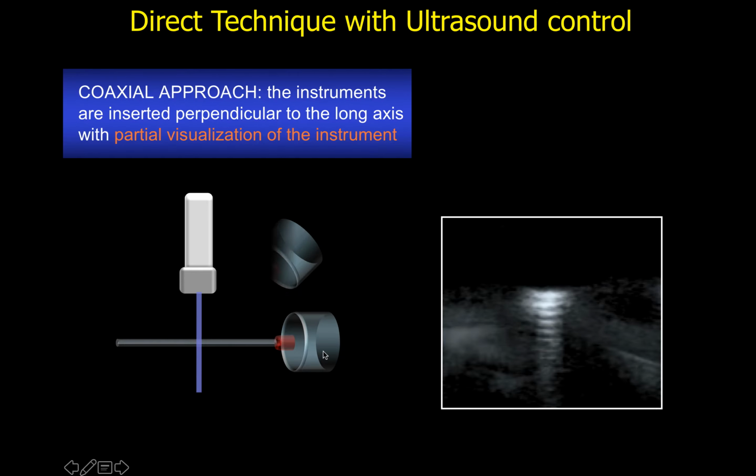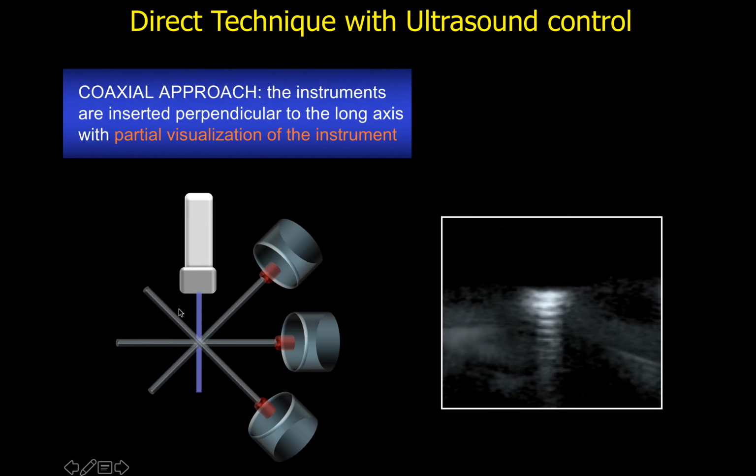The only problem is that in all oblique positions of the needle, we will see the same lightning point in the central when the needle goes through the sound beam, but the bevel could be in different places. This is why the anesthesiologists speak about the approach out of plane.